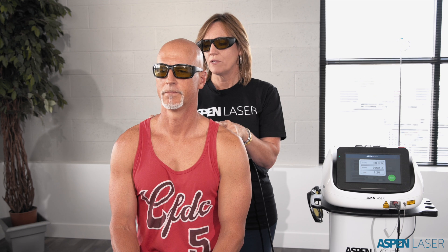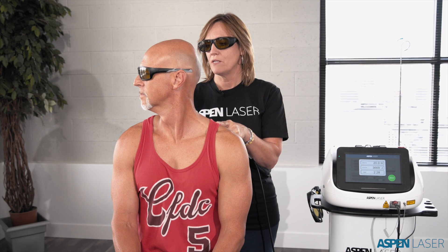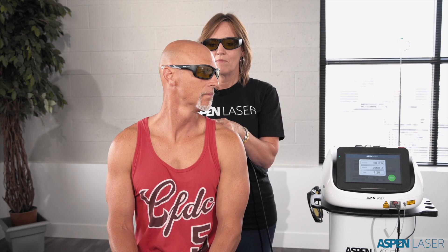Typically a client will notice another pain in the affected area, because we've eliminated the most dominant pain and uncovered a less dominant one. Do you feel any other discomfort at rest? No. With range of motion, please go right and left again slowly and tell me if there's any increased discomfort. Much better.